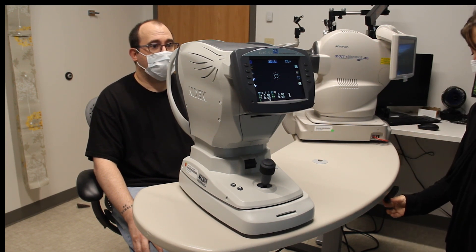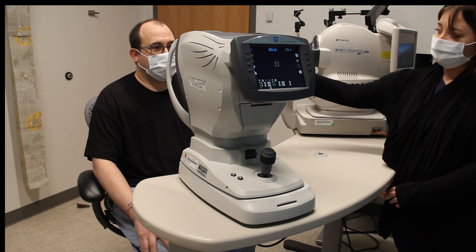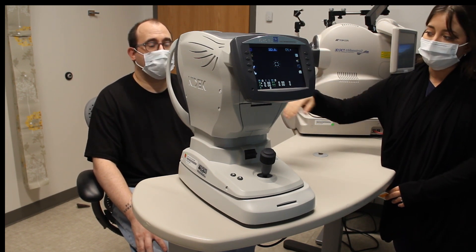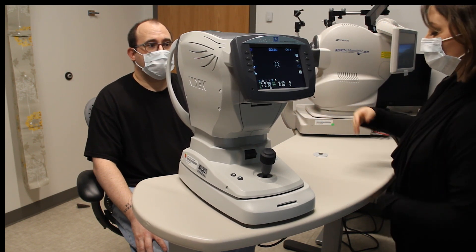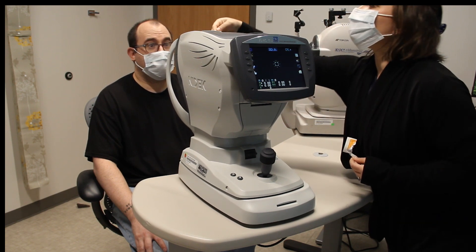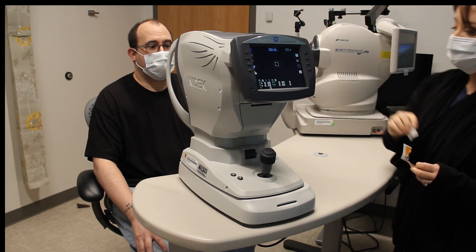First thing you want to do is get your veteran comfortable, so raise the table. You can look at where their chin is — you want it to be about where the chin rest is. Clean both the chin rest and the forehead rest, and give it a little time to dry.